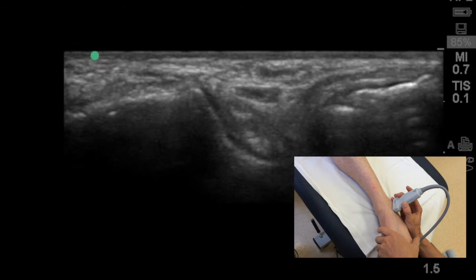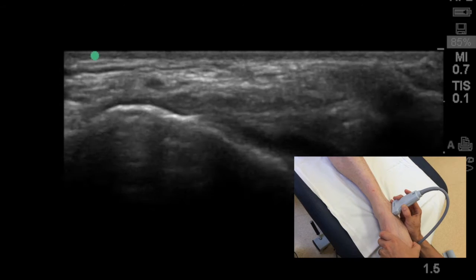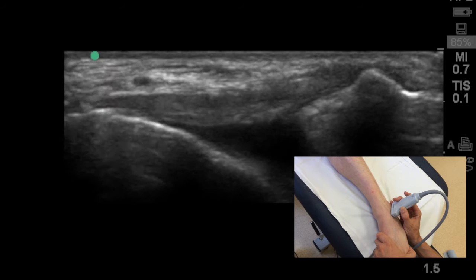At this point, you want to just subtly re-align your probe, fishtailing the end of the probe to try and distinguish the anterior talofibular ligament.